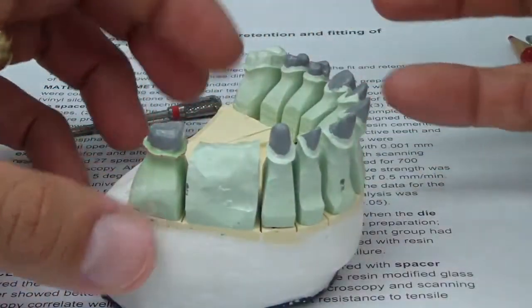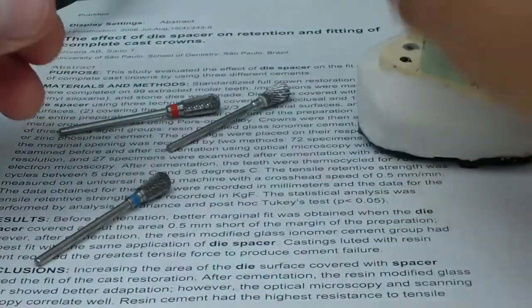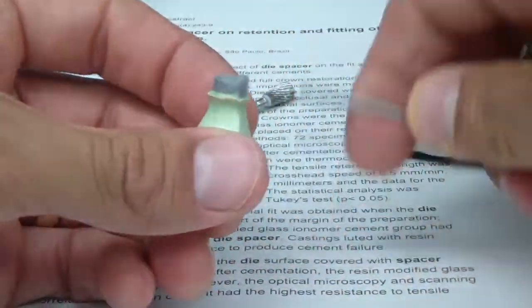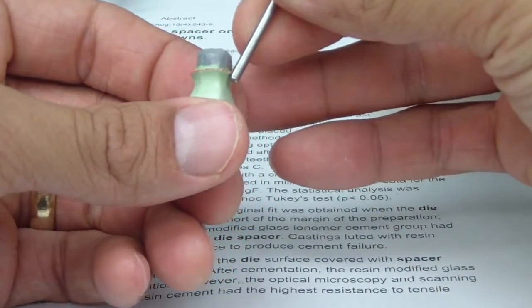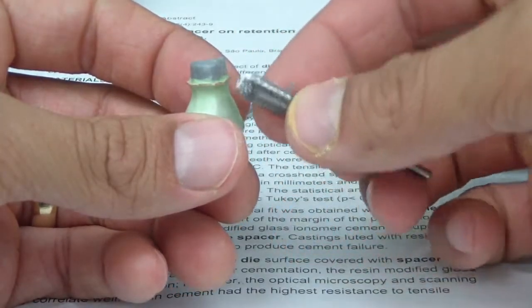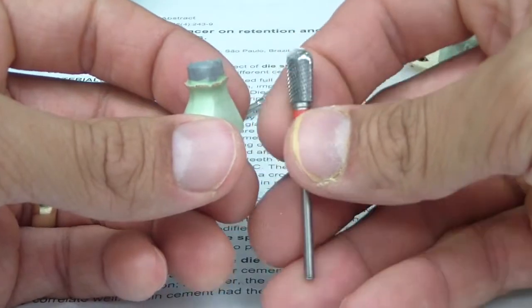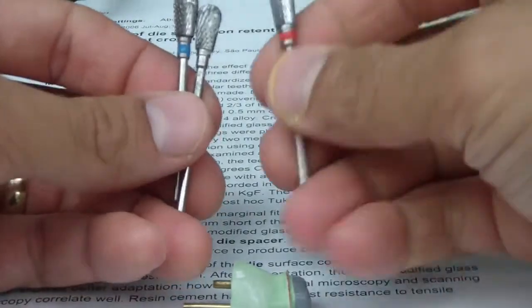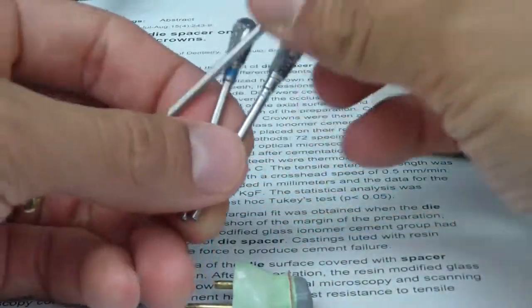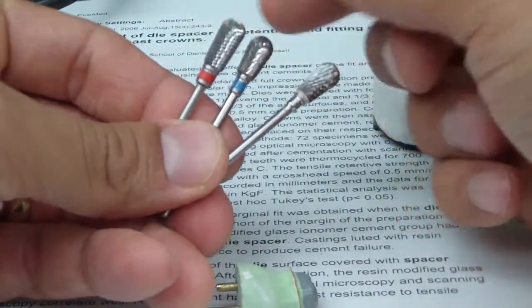So we've got this case here and we're just going to start trimming the dies. One of the things I was taught — and was interesting reviewing Schillingberg — is that when trimming the dies and allowing a nice emergence profile from your crown, I was taught in dental school to use a regular football bur in reverse, but actually using one of these pear-shaped burs. There are different grits: coarse, medium, and fine — and these are cross-cut.